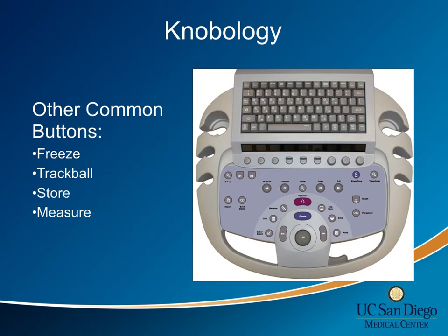The last few buttons you will want to become familiar with are those in the two arches surrounding the trackball. We will spend direct hands-on time showing you how to use them. Just be aware the trackball will operate like a computer mouse or cursor, and the other buttons will basically allow you to save and manipulate the images on the screen.